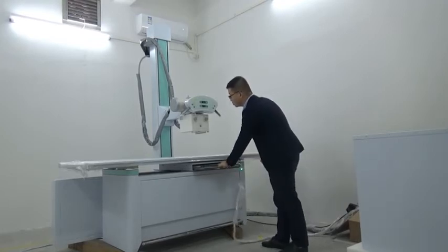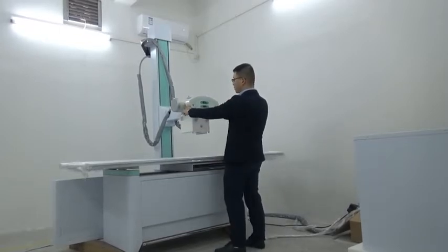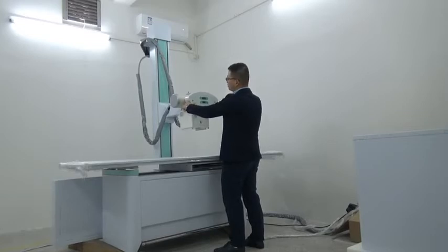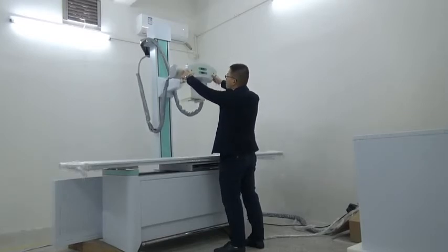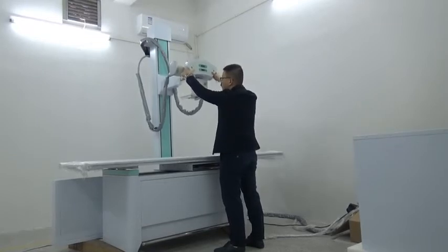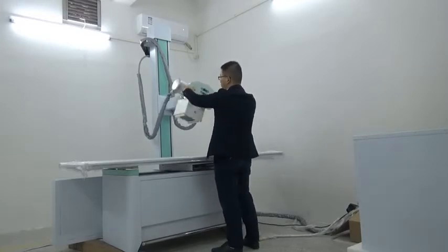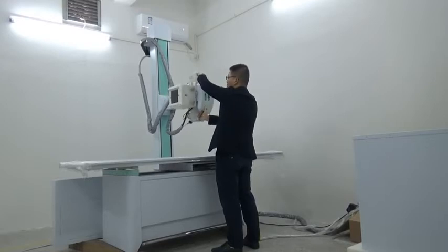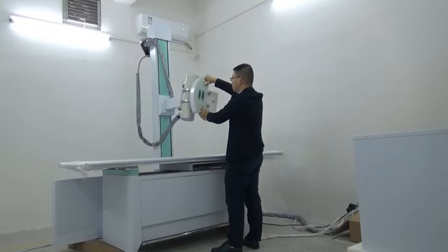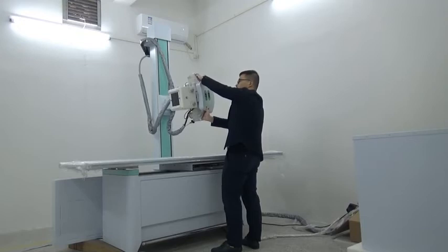Next, I would like to introduce the movement of this machine. The X-ray generator can be adjusted in the vertical direction, moving from 500 mm to 1,280 mm. And the X-ray generator can be rotated from minus 90 degrees to 90 degrees, to meet arbitrary positioning and chest radiography.